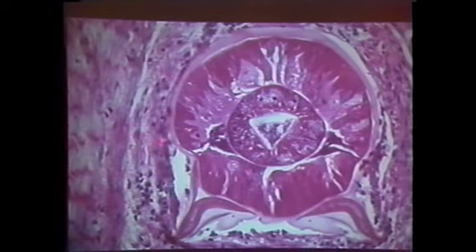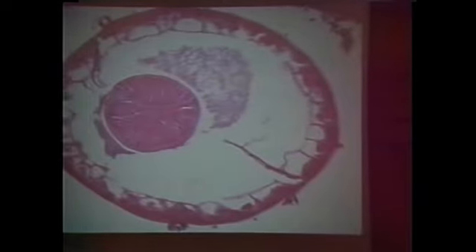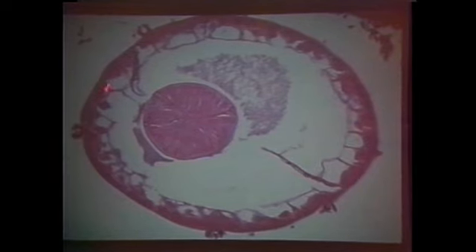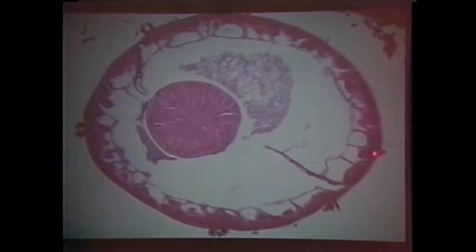Here we go. Here are lateral alae. Look, they're 180 degrees apart. But look at these alae. Here's the lateral area. Look at how these alae have dropped down, evolutionarily for some reason, but these are called sublateral alae. You don't have to remember this. I just want to show you the diverse morphological characteristics they can have. Sometimes in the anterior end, they have these little cuticular things that are either like teat-like, or these look like little, you can snap something on them like a screwdriver. Huh? Okay? And then here we go.